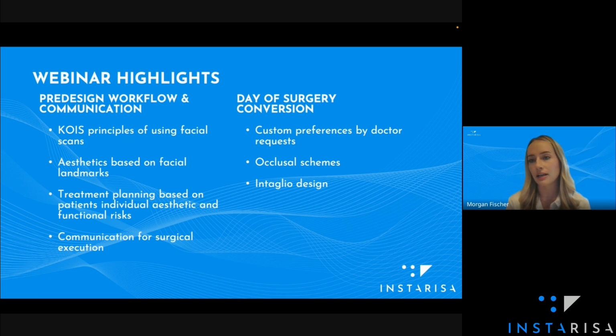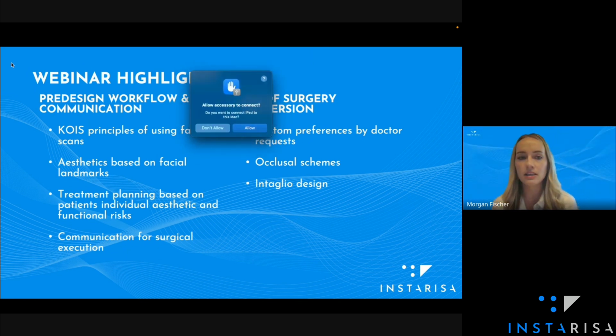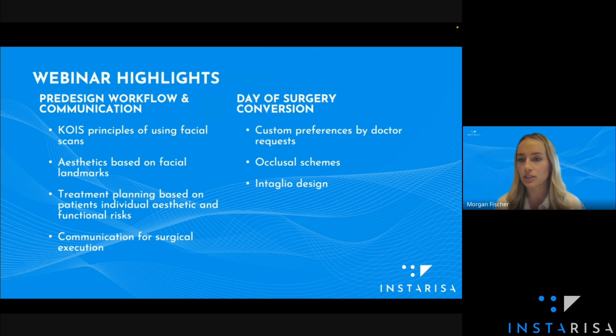And almost every design is going to come with a little note, saying any concerns that the designer has that we need to be aware of on the day of surgery. So if we're looking at a patient that has high lip mobility, you'll get a note on that design saying, hey, from the incisal edge of number 8, I'm measuring 12 millimeters. We need to do 12 millimeters of bone reduction to make sure that we're hiding that transition line. Just anything that's popping out at us.